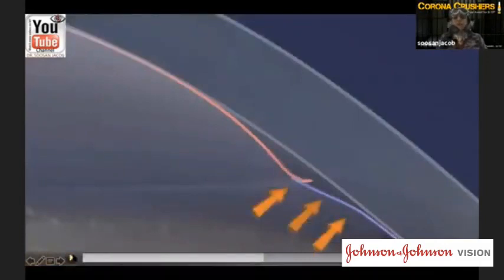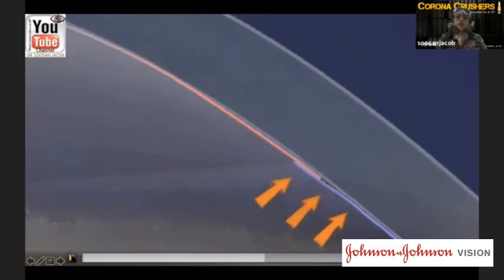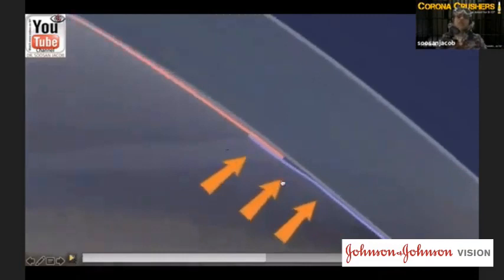Now, my thought was, why would you want to waste that host Descemet's membrane? Instead of having it above the graft, where it can detach the graft, why not use it below the graft as a scaffold? So this is a scaffold technique where you're actually using the host's own Descemet's membrane to prop that graft up and hold it firmly against the host stroma and prevent it from dislocation.